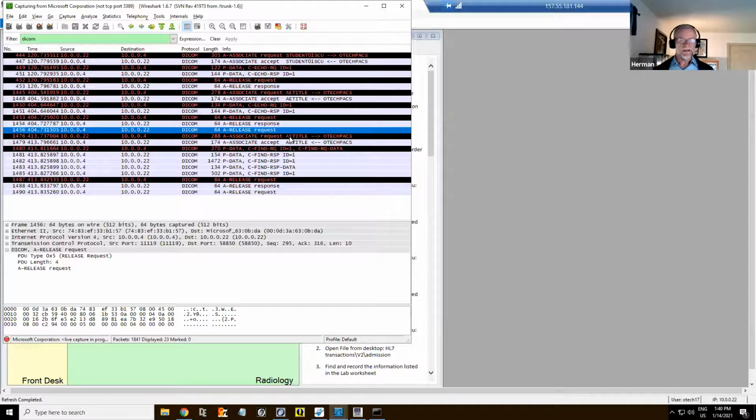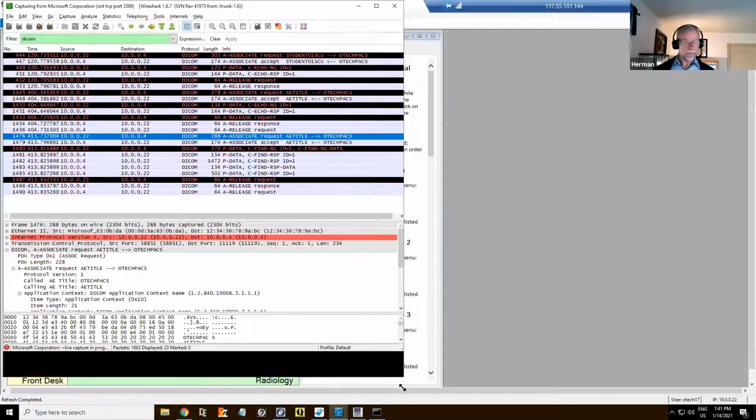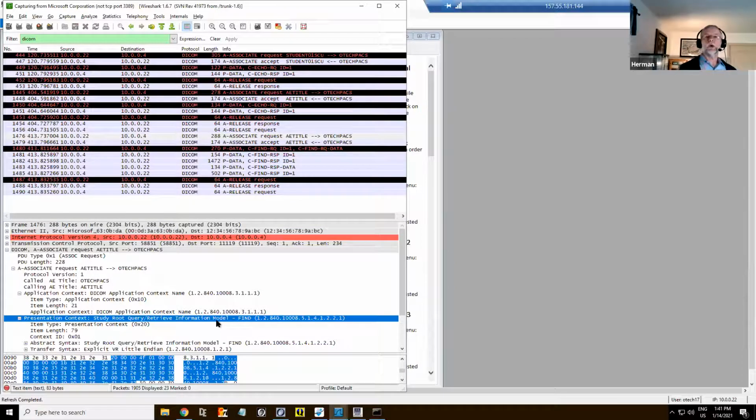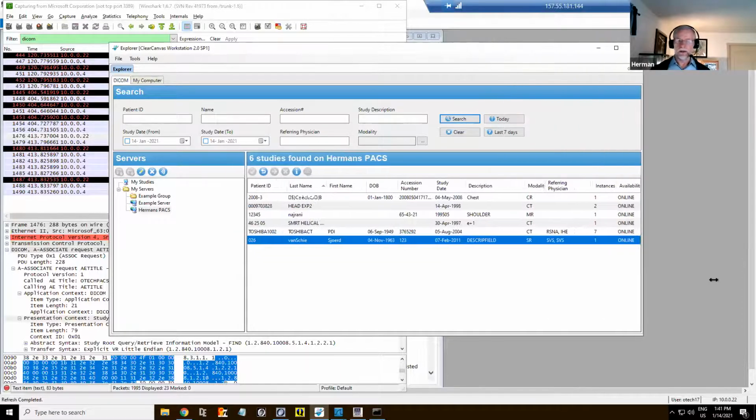Now I did my associate request from my AE title to PACS, associate accept. Now what was requested this time? This time I did a study root query retrieve information model find. So basically I did a query. Remember I did a search? I did a query. What would I expect in a query? Well, if I go back to that workstation, I would expect a query of all of these attributes to be filled in: patient ID, last name, name, date of birth, accession number, and so on. So all of these attributes I would expect to be in my query request.